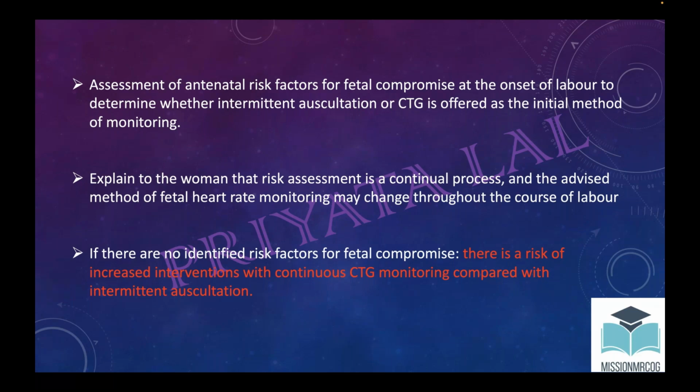Okay, and there could be a possibility that because of an antenatal risk factor you started CTG monitoring, but after 20 minutes you find out that the patient is doing well, so you will switch over to intermittent auscultation. This question is asked in your exams also.